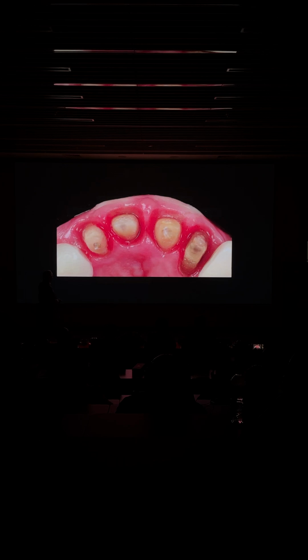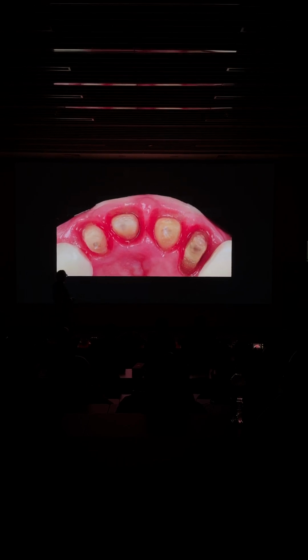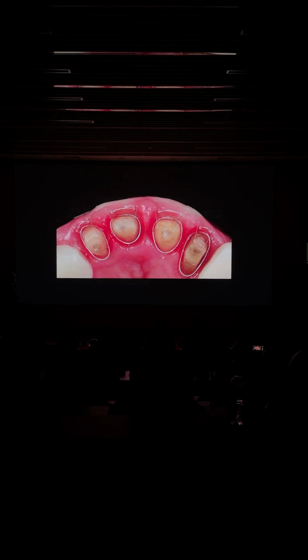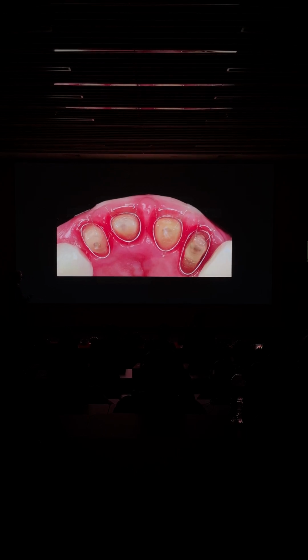You can see the effort here that was performed in order to surgically and prosthetically come up with line angles that have pretty much the same size in order to create an emergence profile that looks similar from one side of the midline to the other.